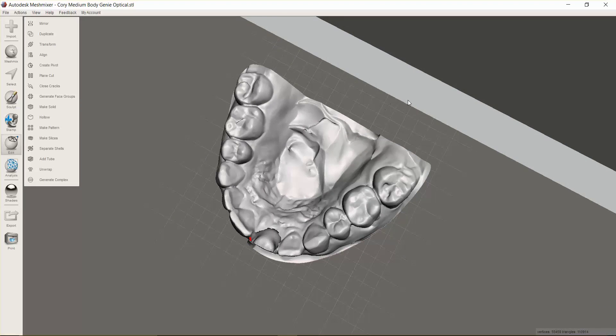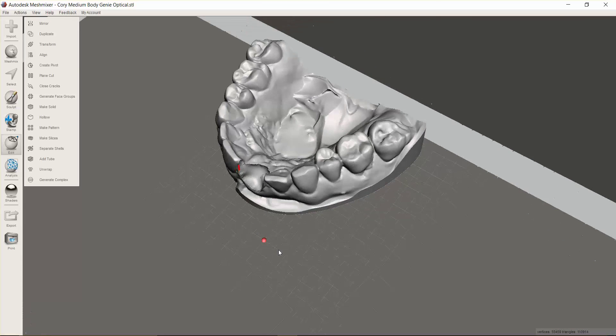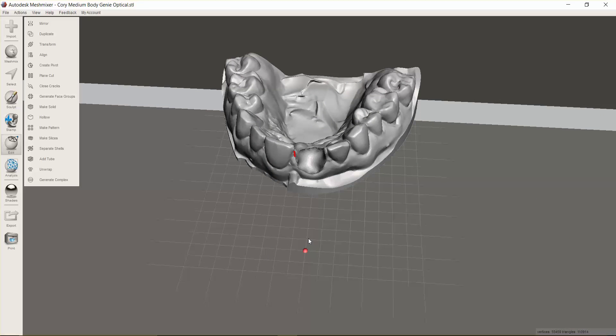This is nice because with the new feature in Blue Sky Plan where we can create an analog hole, you can import this model, create the analog hole, and now you can really create a very nice temporary without having to modify your model at all.